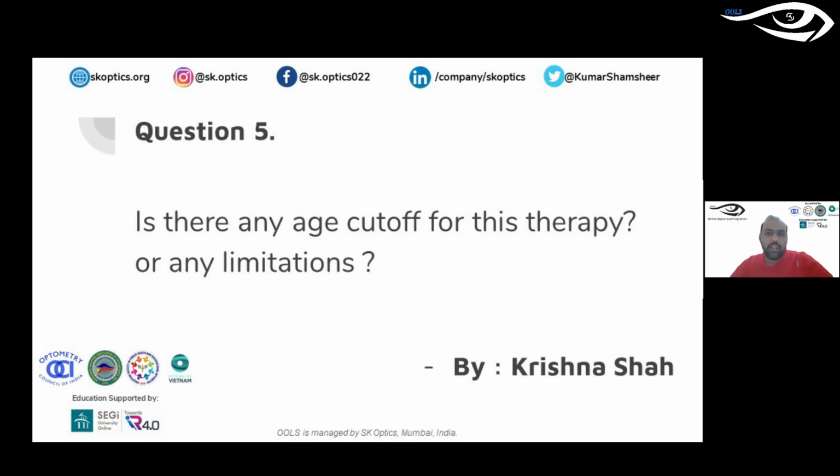Once they have reached their optimum visual acuity, do you call them back and still continue therapy in a slow-down progression manner, or once they have reached 6/6, do you stop giving the therapy? Once we see that they're at 6/6, we stop the therapy. You stop the therapy and just follow up to see whether there is any regress? Yes. Of course, we do call them for follow-up, but once we see that they have reached 6/6, we stop the therapy.